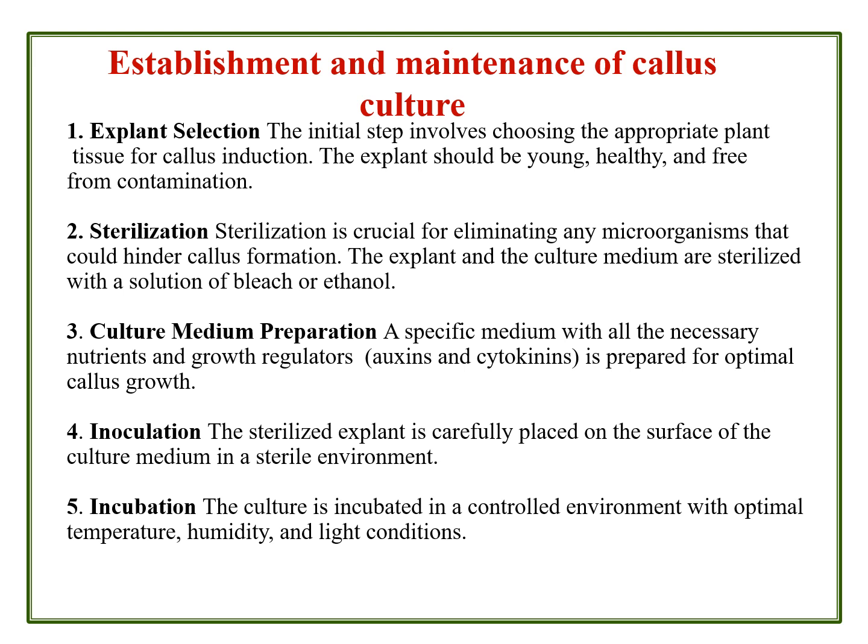Once they are completely cooled to room temperature, only then are the petri plates covered with the upper lid and sealed with paraffin film. Leaks must not be there. Paraffin must be properly placed at the edges of the petri plates to avoid any passage of contaminated air. Of course, within the laminar airflow chamber it is negligible, but about 1% contaminated air may pass through the edges of the petri plates.